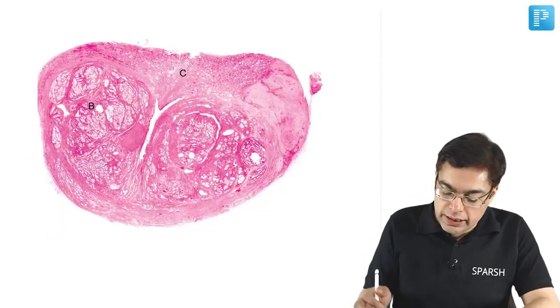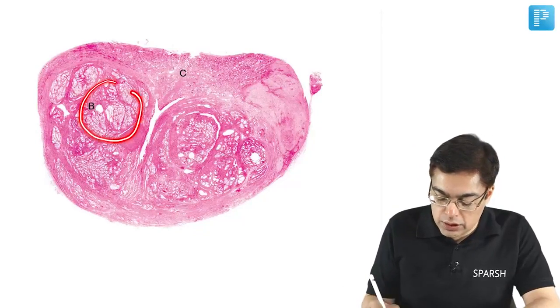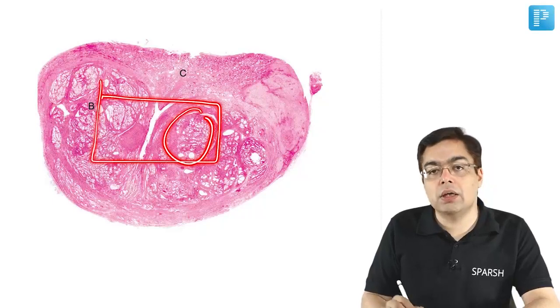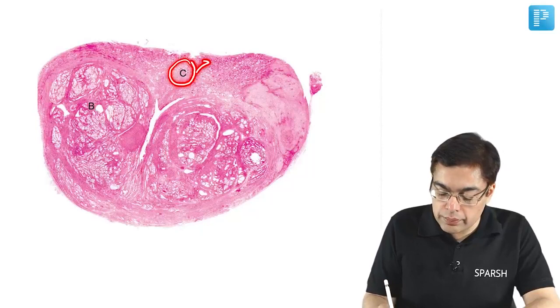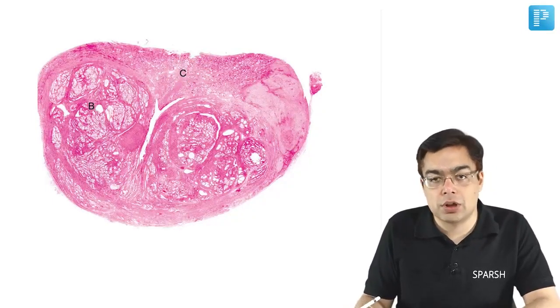Now that would be an example of a slide which is going to be demonstrating what I was telling you earlier, that when you're talking about something like a benign condition, that is going to be causing involvement of the periurethral zone, therefore causing compression of the urethra and causing the symptoms in the patient. When we are talking about the cancerous growth, that is going to be peripherally located and therefore not initially manifesting in the form of causing an obstruction to the patient.